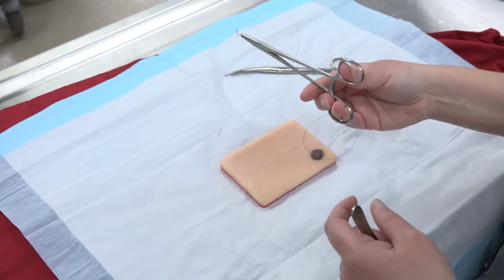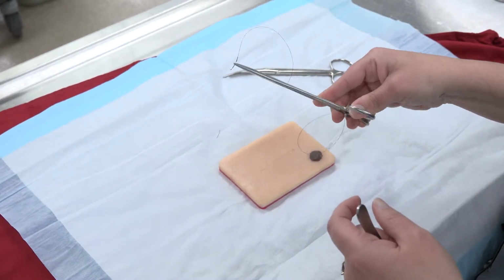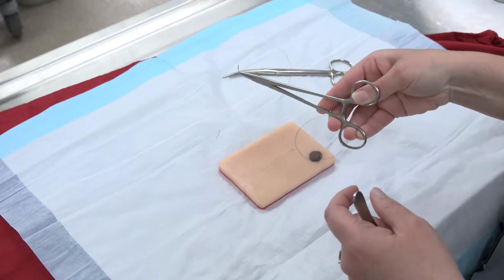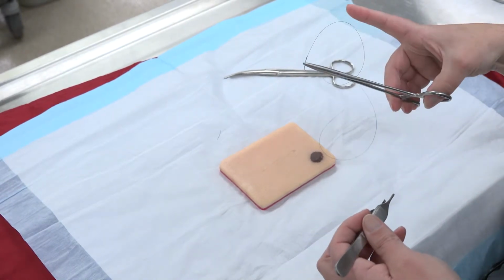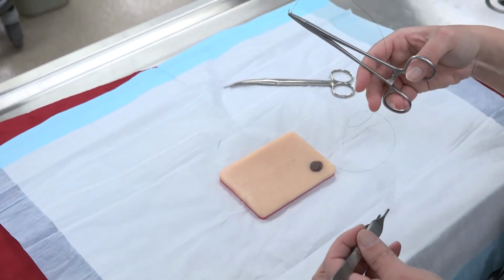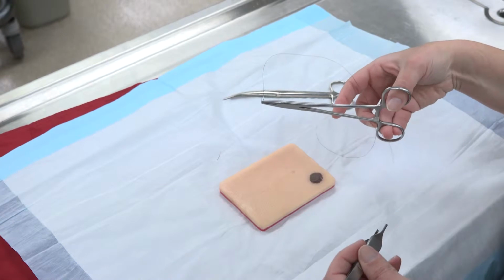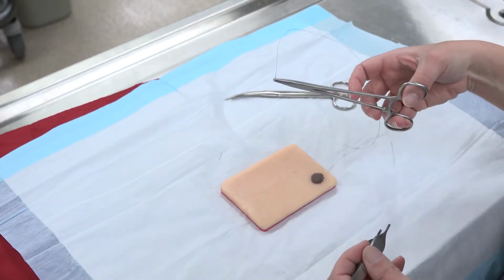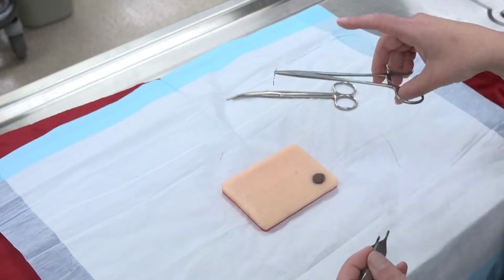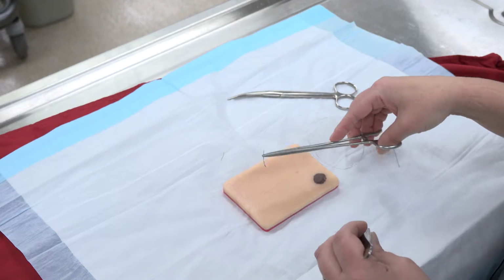And that might mean having a little bit of counter pressure. Because see, look how much I can rotate my needle just with my fingers. And so that's really important if you're manipulating suture. The other thing you can do is with this finger free, you can actually hold your suture away from your skin incision so that you can help control your suture just a little bit. Now make sure you don't get it all tangled so that when you let go you jerk your suture back out, but it can help.